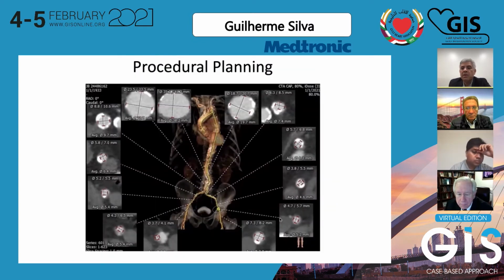Dr. Koseli, do you want to comment about the AAA, about the access? We not infrequently encounter some of these patients with moderate abdominal aortic aneurysms. They don't really pose much of a problem.